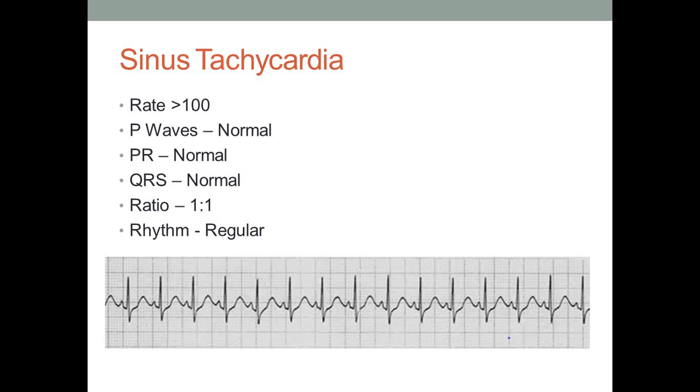Sinus tachycardia, exact same thing as your normal sinus. However, the heart rate is greater than 100. So again, go through every single one of these steps. Really focus on determining where the outlier is in these steps.